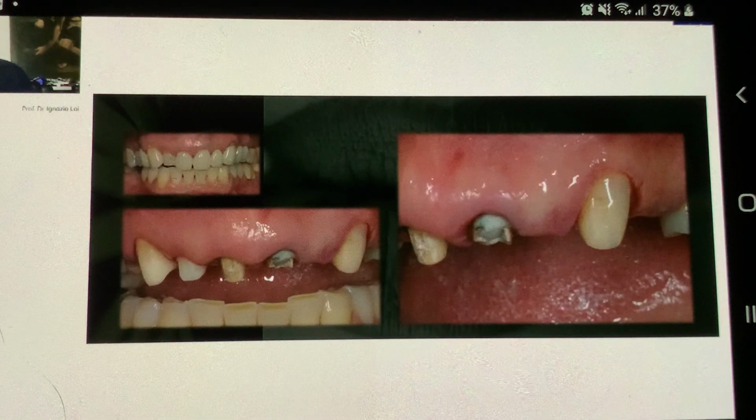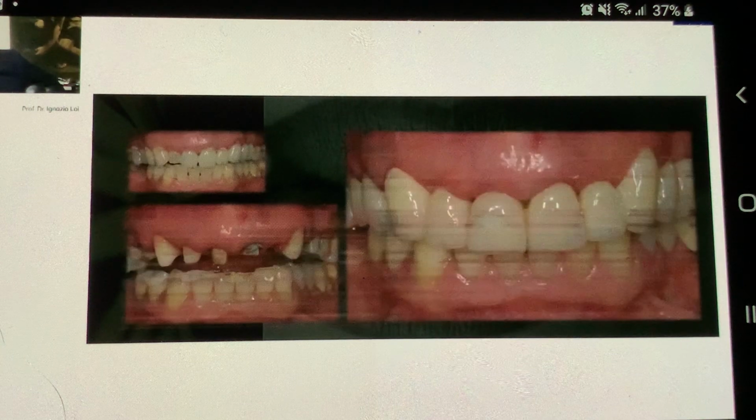So I decided to put the provisional teeth, not treating the central incisors. Never treat in a flapless way, in a vertical way, teeth whose internal anatomy you don't know very well, because this would cause damages and disadvantages, not advantages.